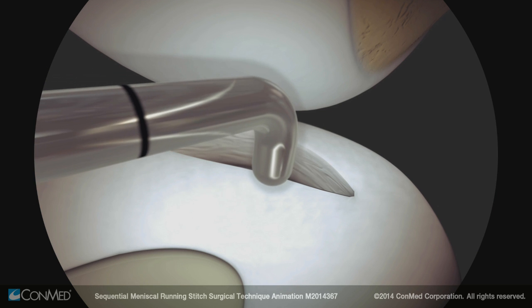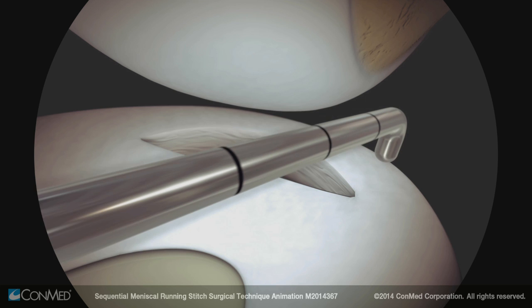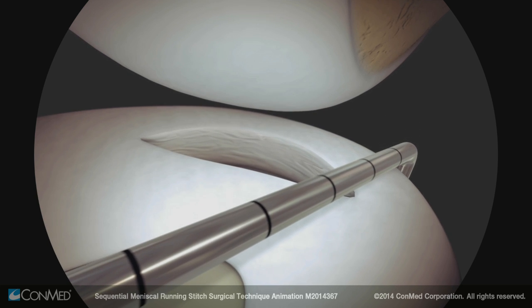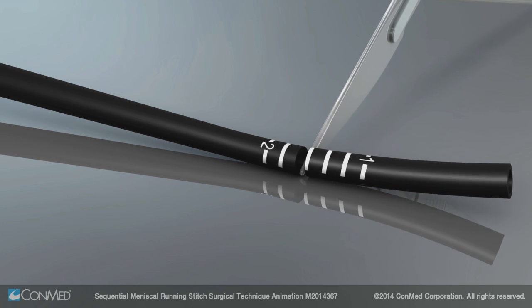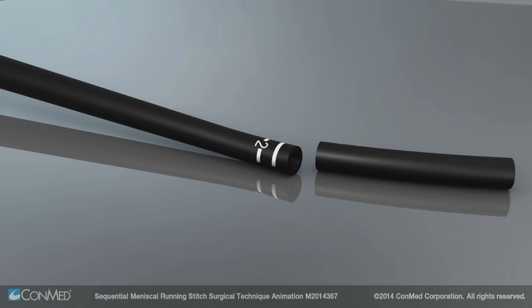For the sequential meniscal running stitch technique, use a probe to approximate the deepest depth of needle penetration that will be needed. Cut the depth stop sheath to the appropriate graduation. Ensure the depth stop will allow the needle to penetrate the meniscus at the deepest portion of the tear.